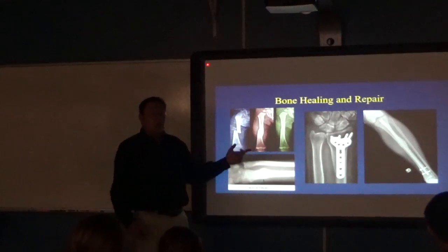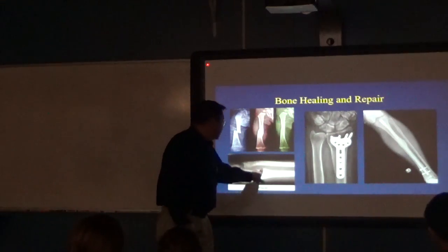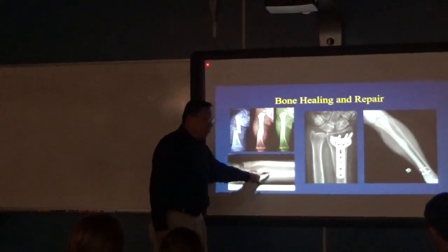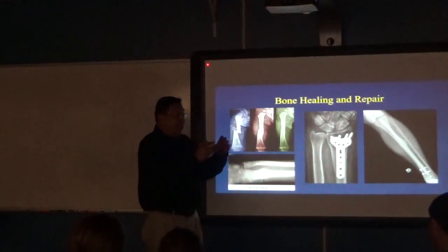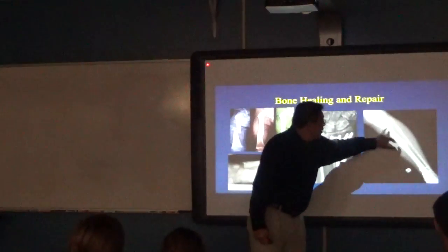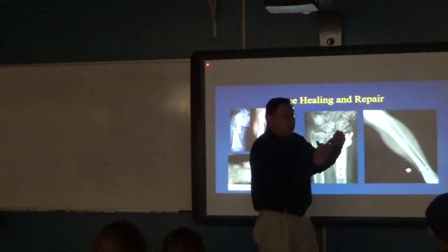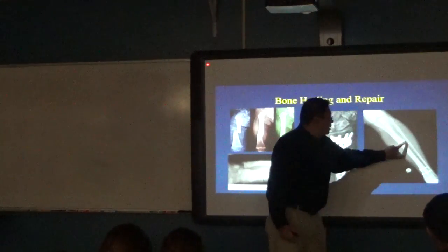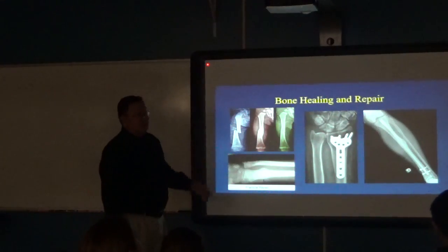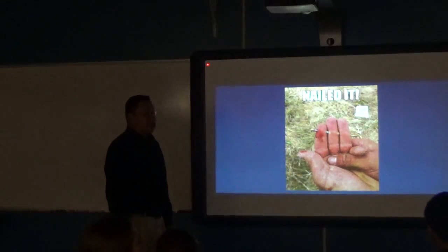In primary fixation, where you put the bones together where they're supposed to be, you don't see callus formation. They consider it primary healing. This is called secondary healing, when you see callus. Primary healing is just, it heals and you don't see any outside bone. This is secondary healing, because the rod that comes down here did not make the fracture fit like a puzzle. That's why you got secondary healing callus there. And if you understand these basic concepts in healing, bone cells and everything, you can say to yourself, you nailed it.